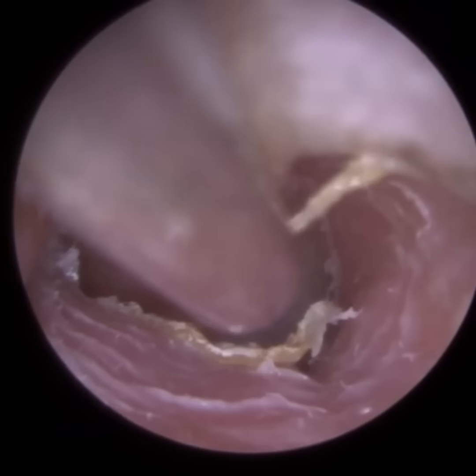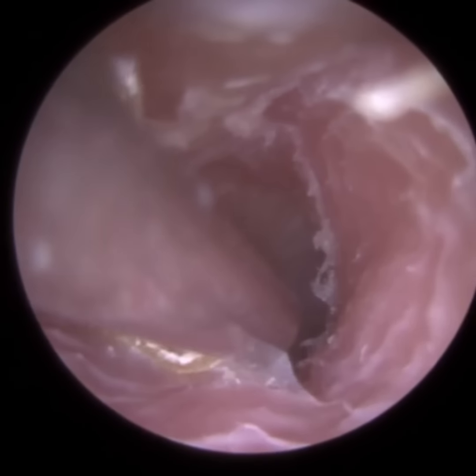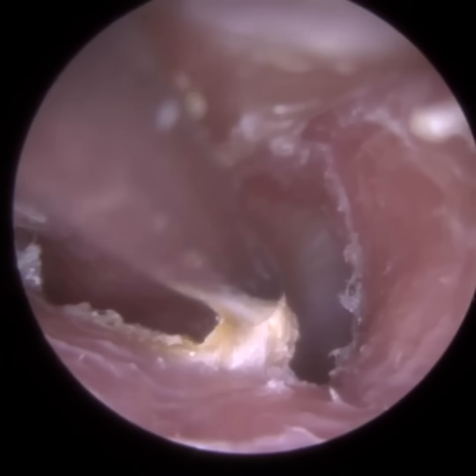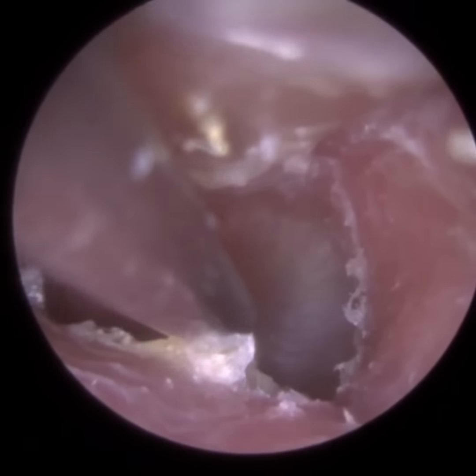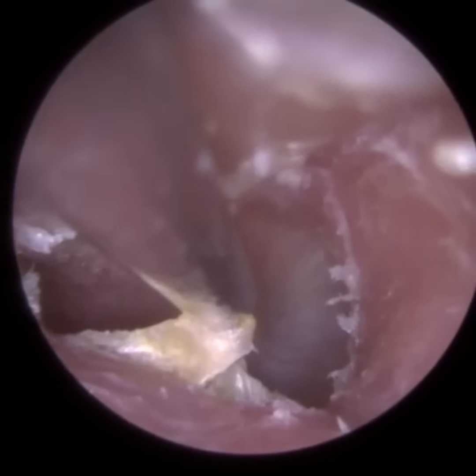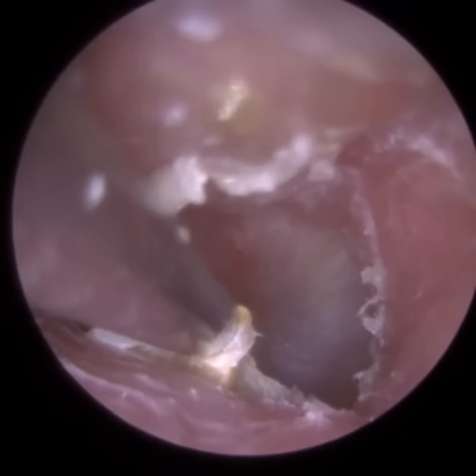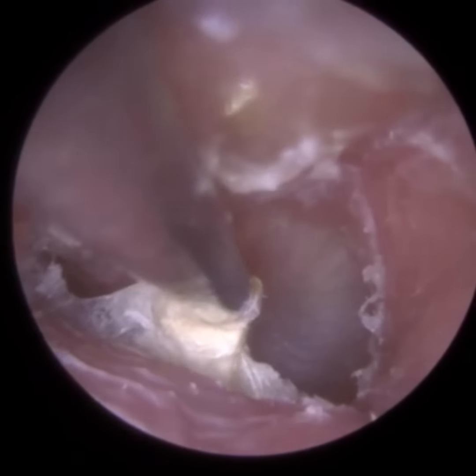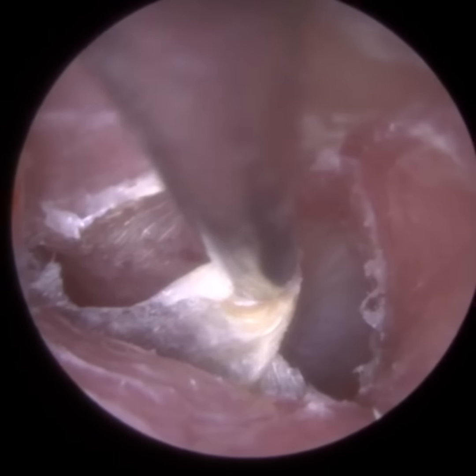You may see that because the patient's ear is infected, there's increased temperature and humidity in the ear, so we get a bit of condensation on the lens of the endoscope. As soon as you go in with a suction probe, that condensation disappears, it evaporates. If I just left the endoscope in the ear for about 30 seconds, it itself would remove the fogging and misting and the condensation.